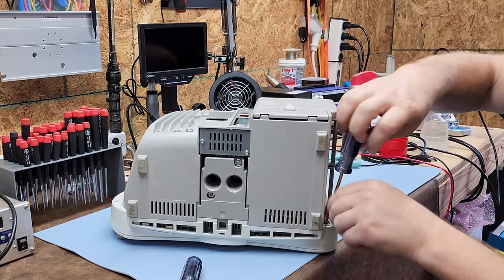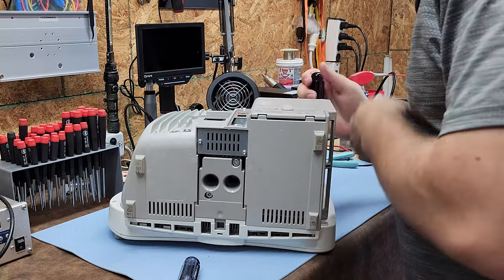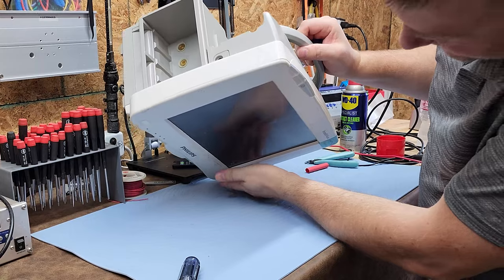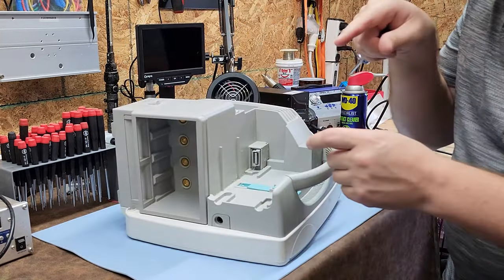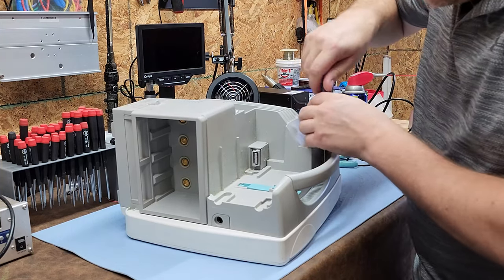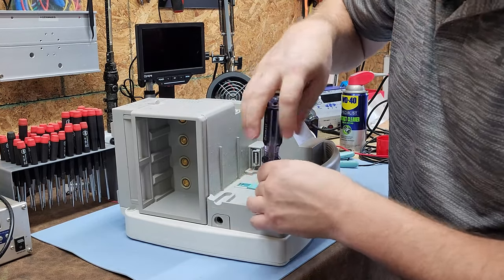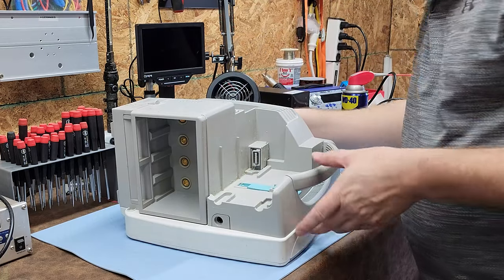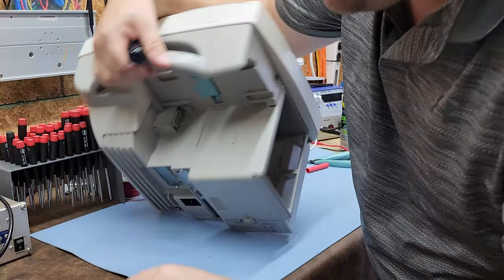I'd love to use an extension and bit set but we'll work with what we've got. Keep in mind it's not good practice to lay this device on the rotary encoder button — it's a rotary encoder that also has a push-button selection feature. I haven't proven it works yet and I'm being very delicate, so it's okay for now.